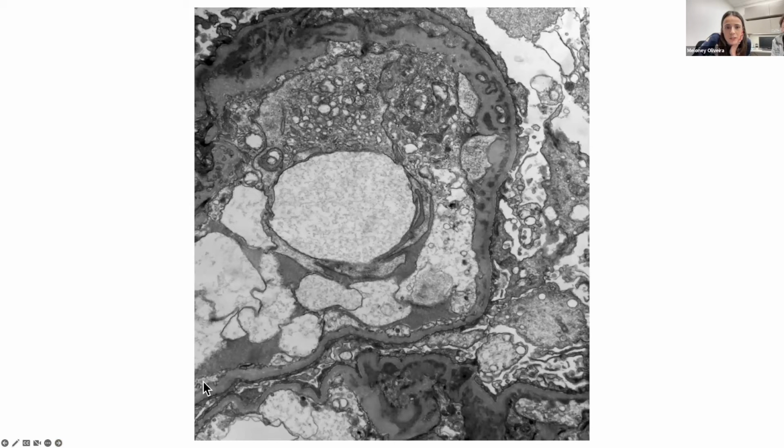Okay, so here, is this the glomerular basement membrane? Is this mesangial interpositioning then? Yes. And then this is the capillary lumen. You can see how narrow that lumen is now, becoming very narrow. It reminds me of the one he pointed out on the light, where there was a tiny little hole there with a lot of complexity.